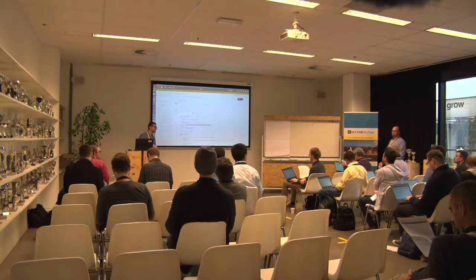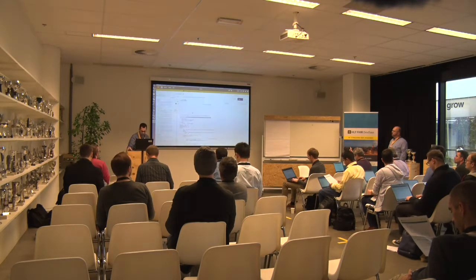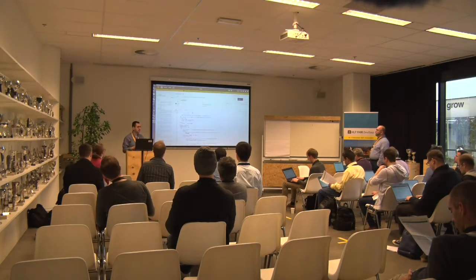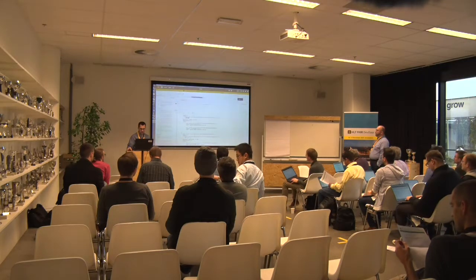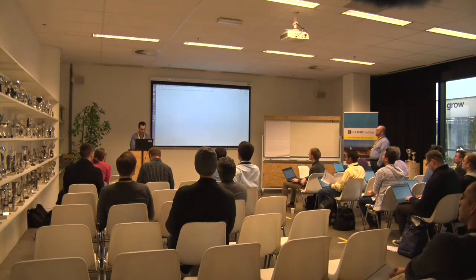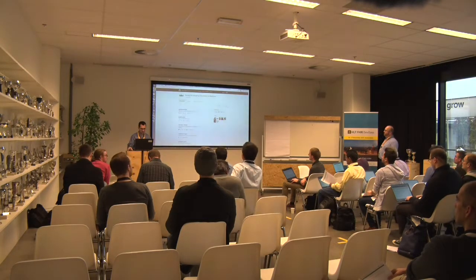Sorry, question? I was expecting to find a list of modalities, or is that optional? I think this one has it here per series, because modality. At the series level you have the modality, but at the study level, a list of modalities? That's a good question. You know what? Let's see if we can actually take a quick look. We actually are good on time, so let's take a quick look at the GitHub repository and see. We have 10 minutes.